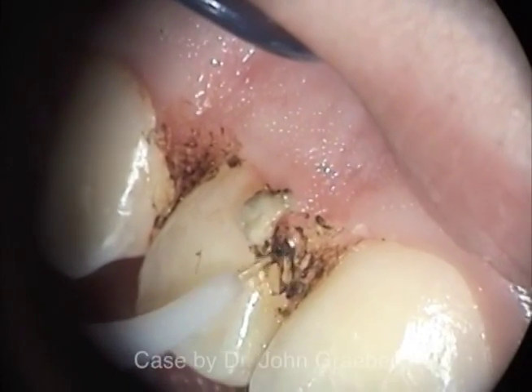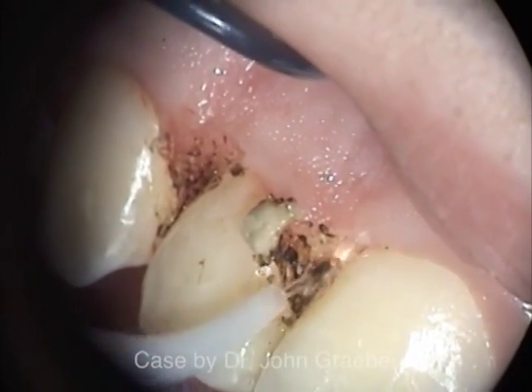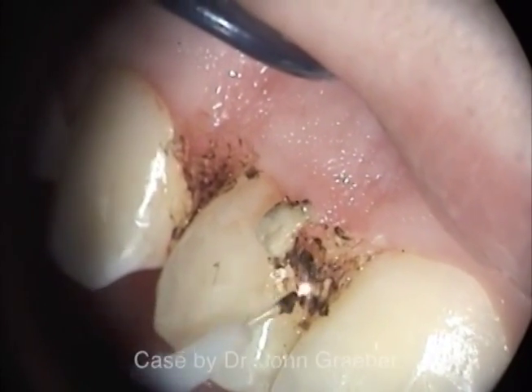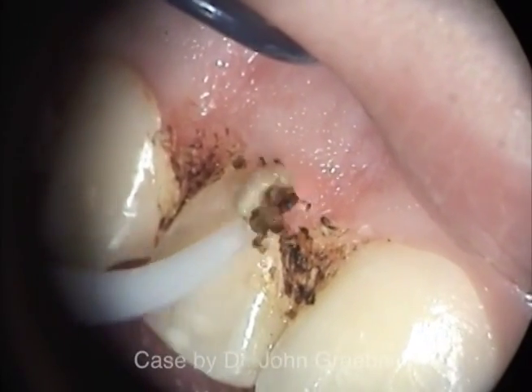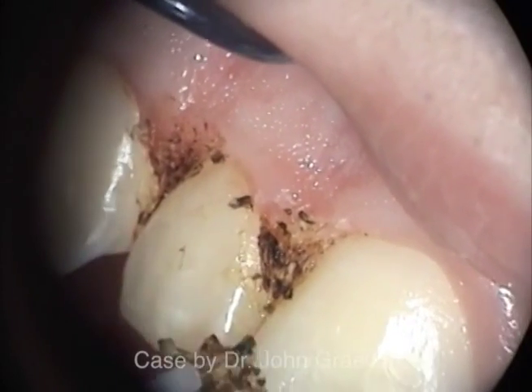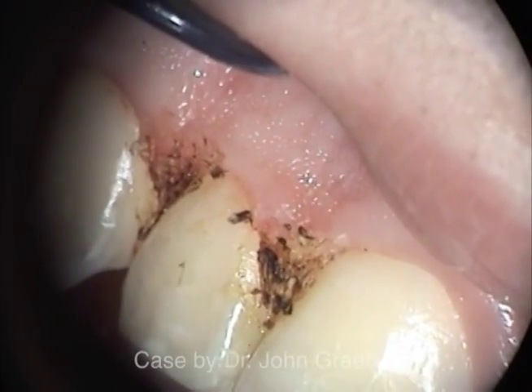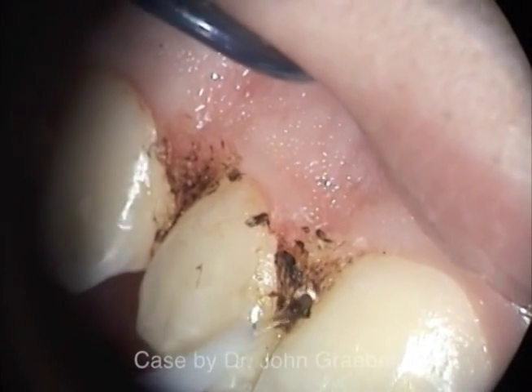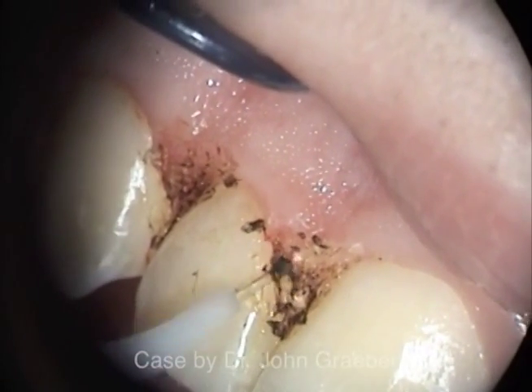The final rinsing with an air-water syringe demonstrates the thickness and integrity of the coagulated connective tissue. This layer will protect the underlying tissue from post-operative bleeding and seal the sensory nerve endings.